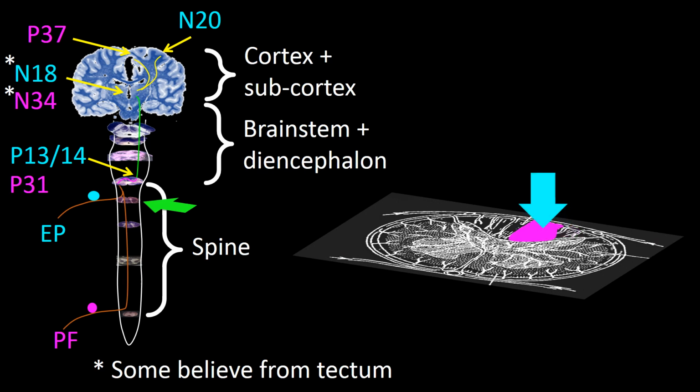On the other hand, an abnormal posterior tibial somatosensory evoked potential and a normal median nerve somatosensory evoked potential indicates, again, at least theoretically, the affectation of the gracilis fascicle and nucleus and the sparing of the cuneatus fascicle and nucleus. Once more, we must remember that this is basically theoretical consideration, and other possible localization for the damage should be considered way before we think of this option.